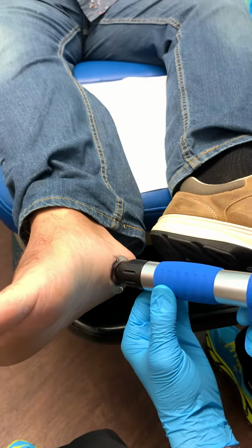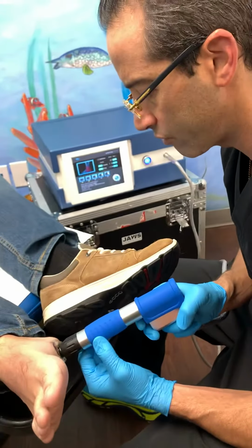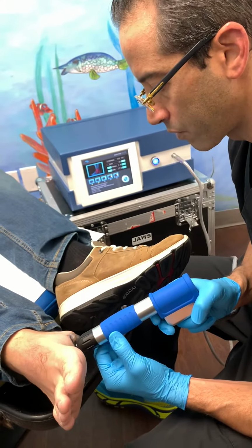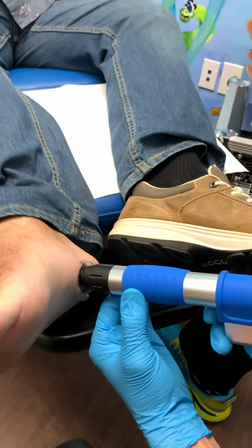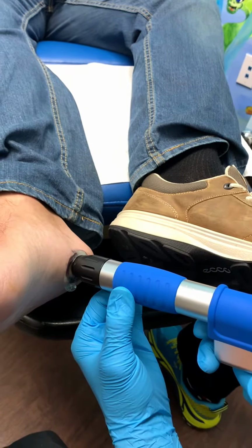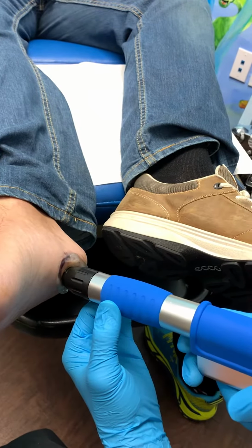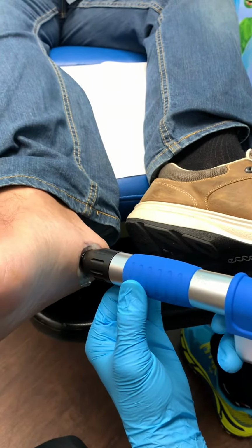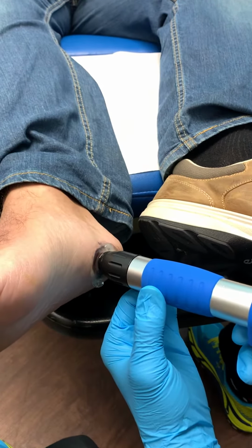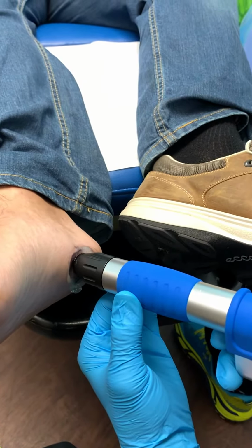There are certain contraindications to this procedure, and we will discuss these at another time. The procedure itself takes about 7 minutes, and it also depends on the frequency. I can control all the parameters.